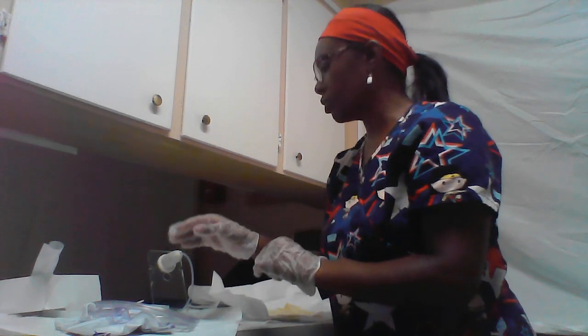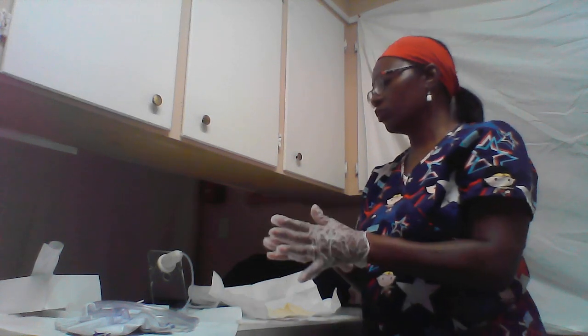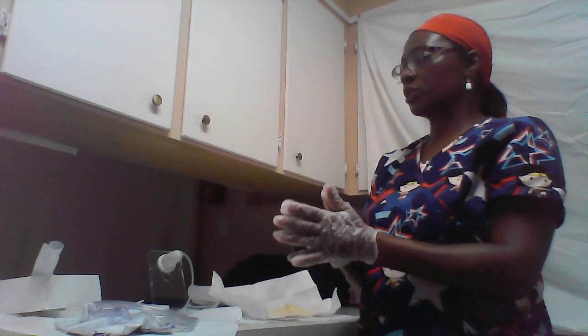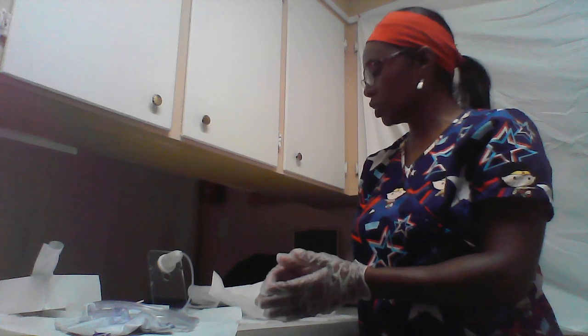And then once that's all completed, I'm going to reposition my patient, make sure that he's comfortable, all the supplies are disposed of, remove my gloves. Once that's complete, I'm going to document how the patient tolerated the procedure, the size of the catheter that I used, how much urine was flowing in the catheter, and how the patient tolerated it.